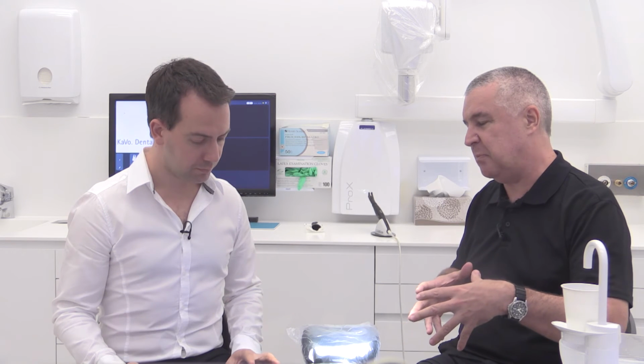And I think the patients get encouraged by the fact that we're trying to be as conservative as we can for them. We're not racing into restore. We're saying, well, let's give this a chance to go. We're pretty sure the surface isn't broken. You haven't got symptoms yet. Let's try to gain you some arrested or reversed enamel caries, back into sound enamel, and stay with that. So that's just a much better way to go. Look, I agree. I hope my patients appreciate the same thing.